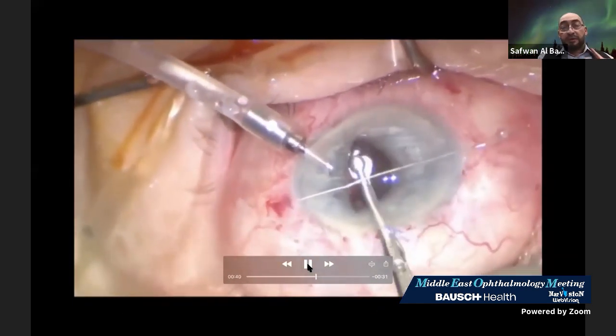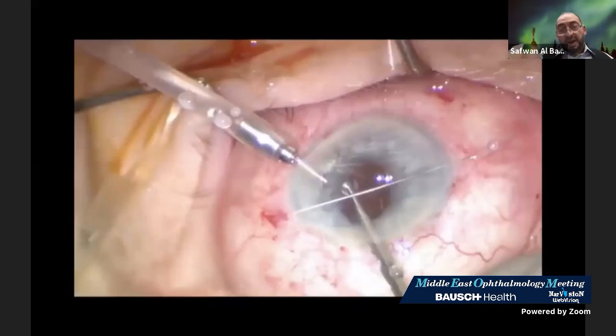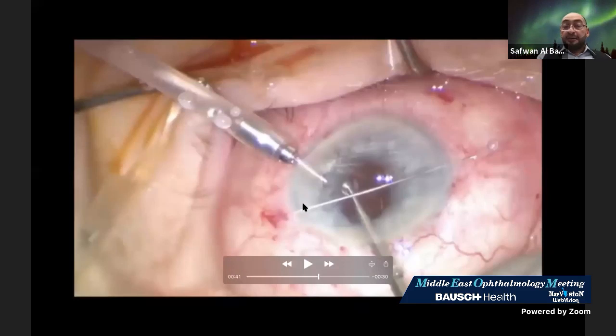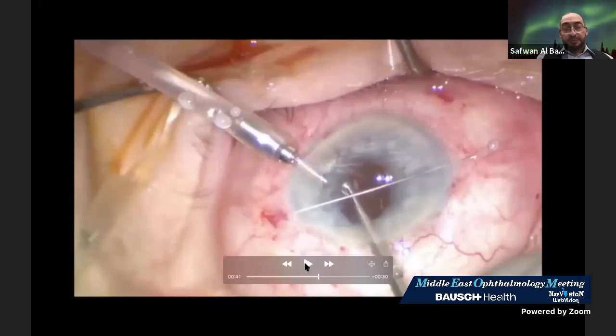See now this maneuver. See how here he pushed toward the left side, and in this way I went down, because I'm a very curious person. I went down when I did it, and I saw that on the left side I created a trauma to the ciliary body and to the peripheral part of the retina. Now, that's why I stopped using it.